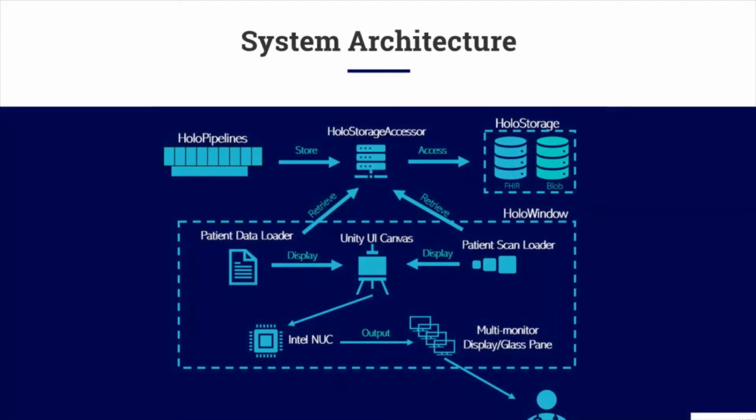Our proposed system architecture involves using Unity and the existing Holo repository. We send a web request to the Holo repository endpoint via scripting and parse the response stream data using the Newtonsoft.Json library, or save any binary data we receive for later use. The Holo repository uses the OpenVINO toolkit and converts the DICOM scans to GLTF form. The scans are dynamically loaded into a Unity scene using the GLTF utility package, and we attach pre-made scripts that can be used to manipulate the scans. On completion, the rest of the UI is set up and populated.